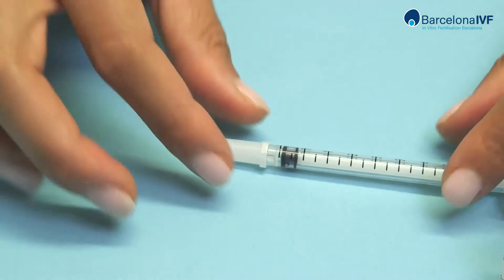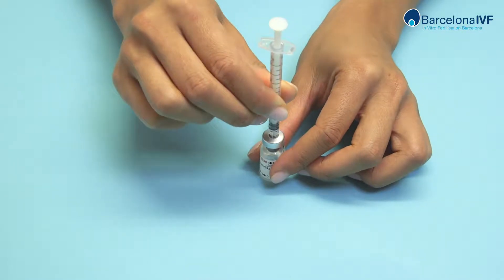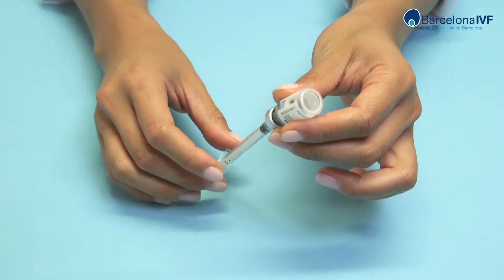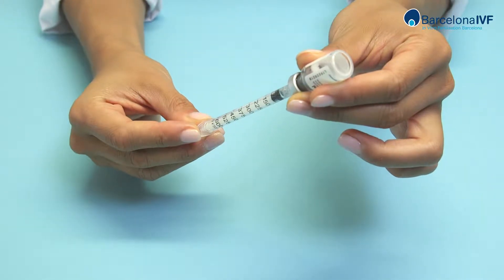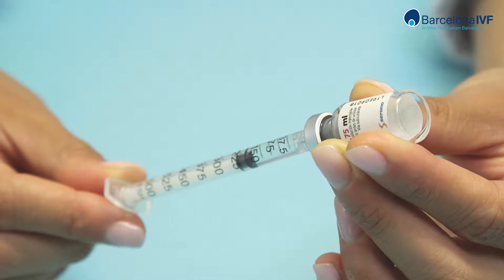Open the disposable syringe for use. With the vial on the table, introduce the syringe in a vertical position. Then, with the syringe inside, turn the vial upside down. Remove the prescribed quantity plus one line more, then remove the syringe from the vial.